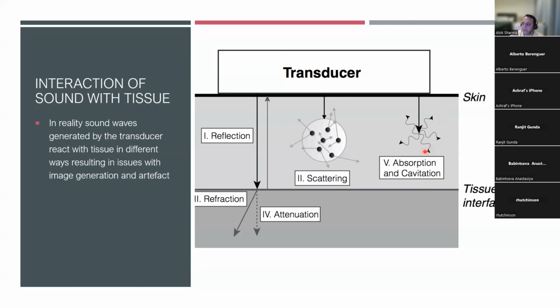But whilst absorption is taking place, the sound wave is also getting weaker. And as it passes through deeper tissue or certain kinds of tissue, because of the issues of reflection, and bone is a very good reflector, it'll just reflect everything back, the energy dissipation in tissue will be higher. And this concept of loss of energy and the waves becoming weaker as they enter tissue after the process of reflection has taken place is called attenuation.